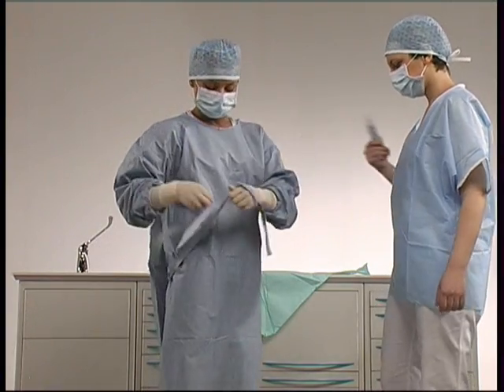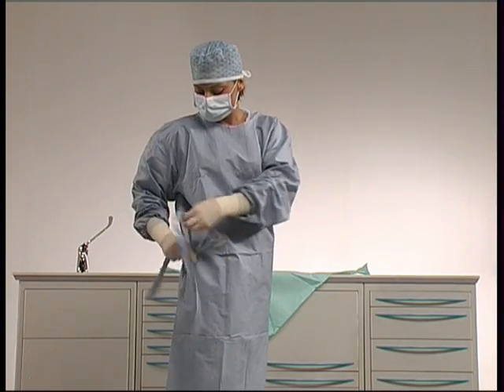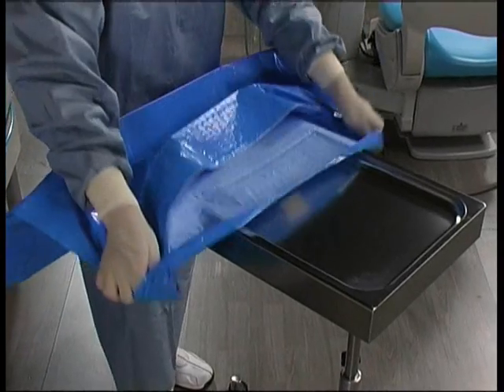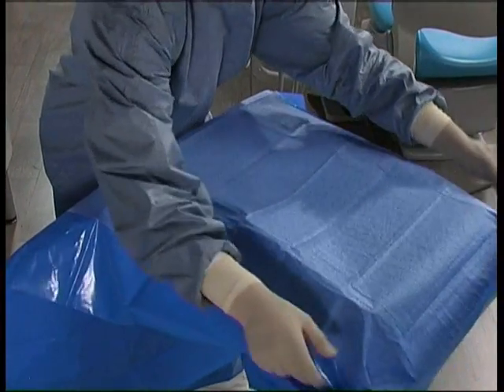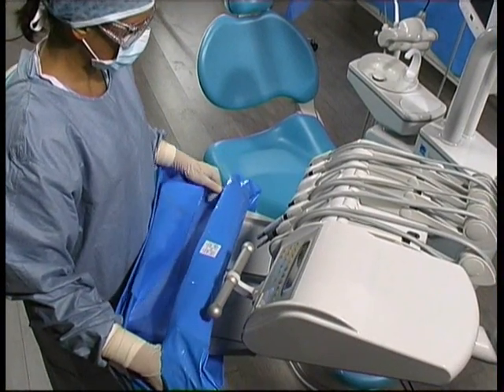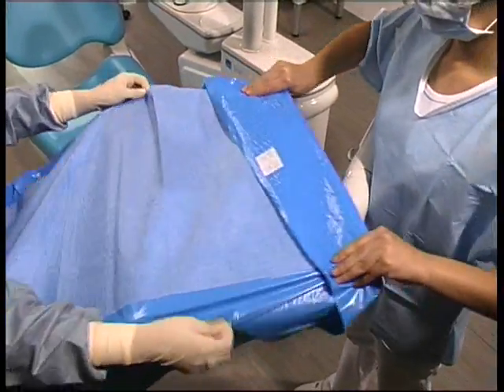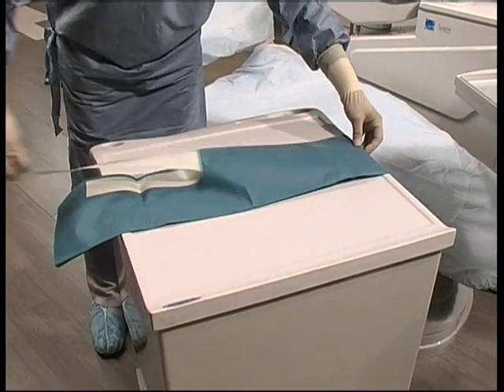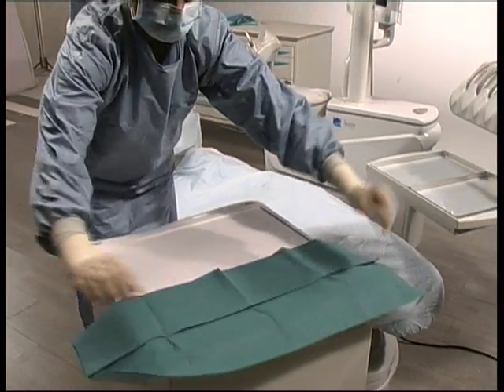From this point on, the assistant is considered sterile and must not touch any non-sterile object. The next phase involves isolating the working environment using sterile protections designed specifically to cover the various surfaces. Using the surgical kit, the sterile assistant isolates the mayo table and the delivery unit using the special cover. The cover is folded in such a way as to be handled also by non-sterile staff if needed. Using a suitably sized waterproof drape, she covers the serving table and the cuspidor unit. The cloth is adhesive to avoid accidental movements during the operation.